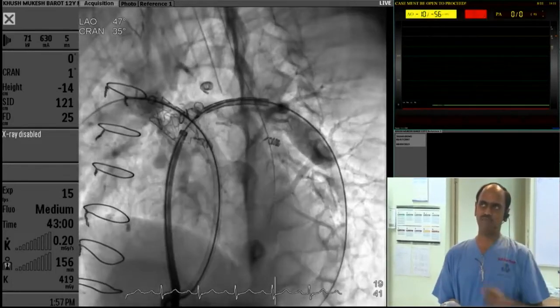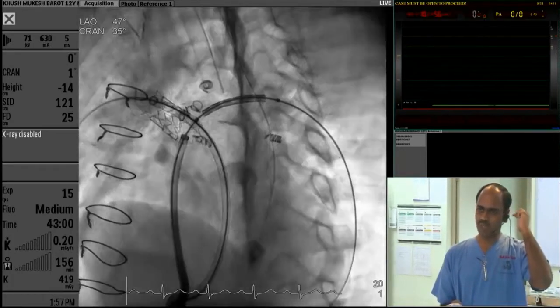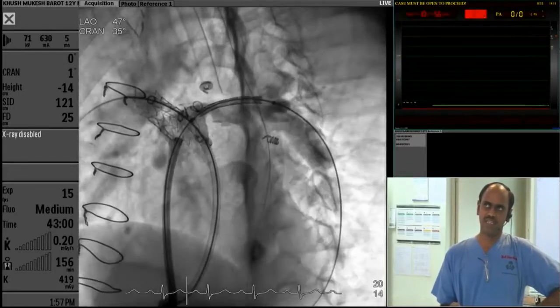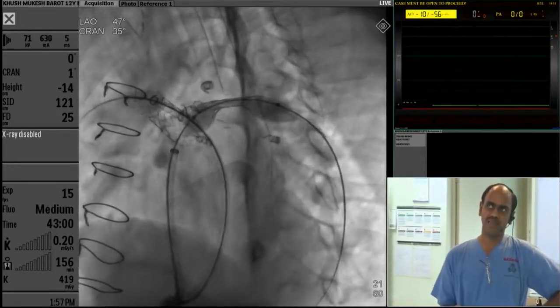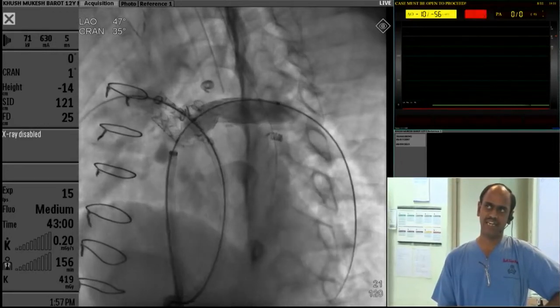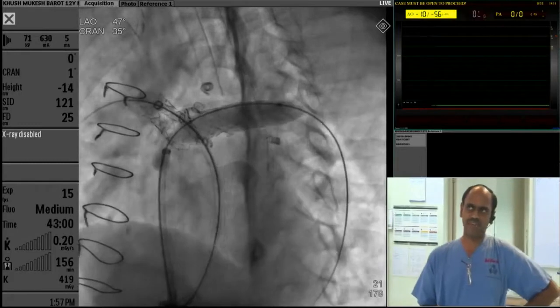Then we positioned for the left pulmonary artery. We thought that in this particular position we are covering the ostium of the left pulmonary artery. This is a non-foreshortening stent. As we deployed, we can see that we are actually catching the waist. That is the tight waist — we were correctly catching the left pulmonary artery waist.